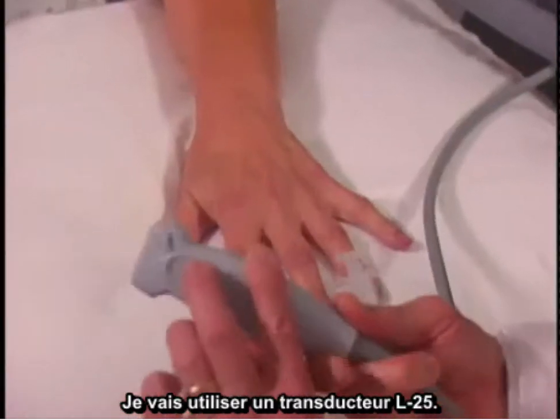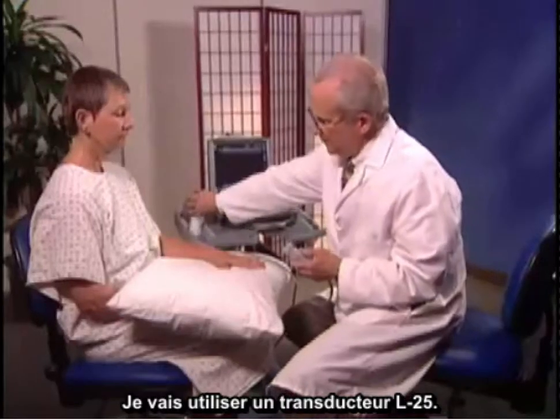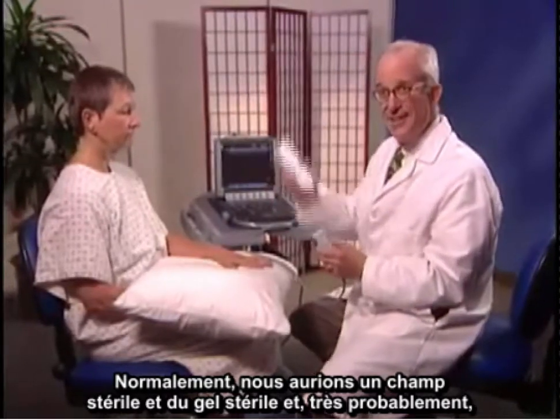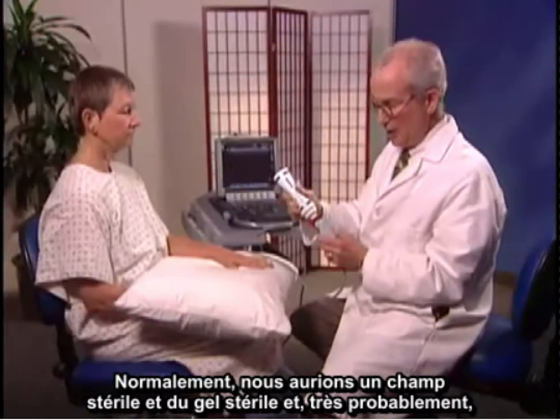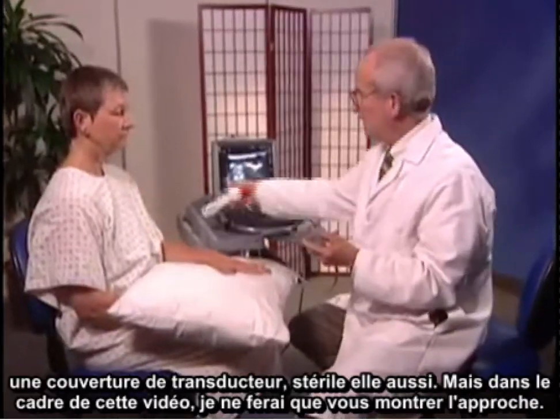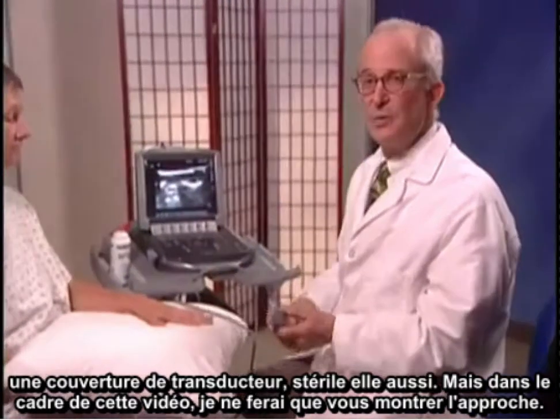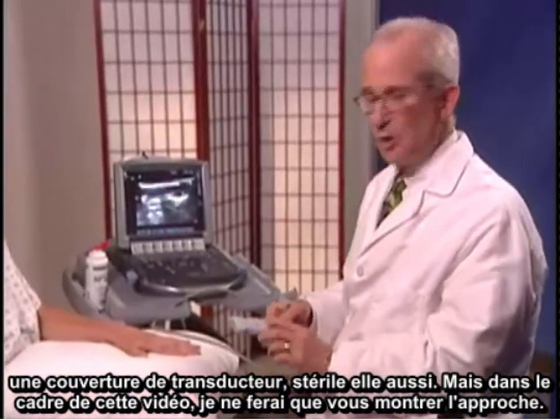I'm going to use the L25 transducer. Normally we would be dealing with a sterile field and sterile gel, and most likely a transducer cover which is also sterile, but for the purposes of this we're just showing you an approach.